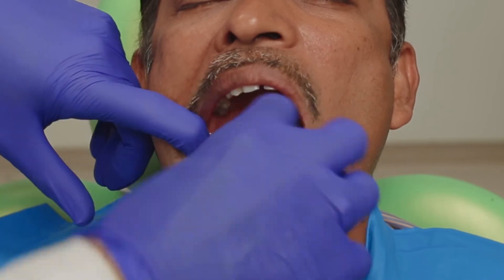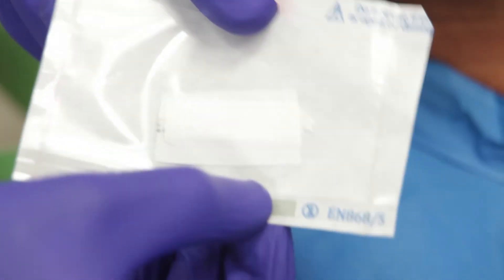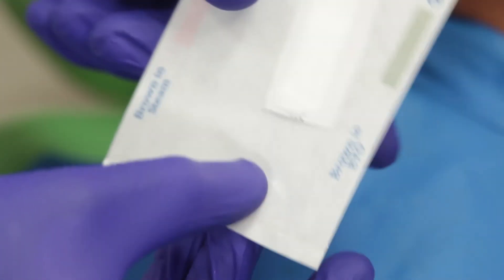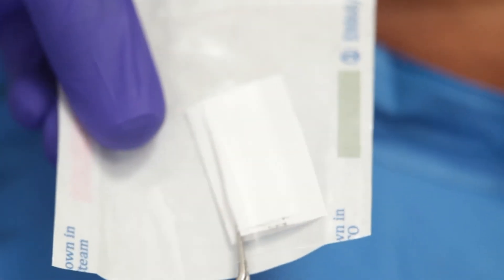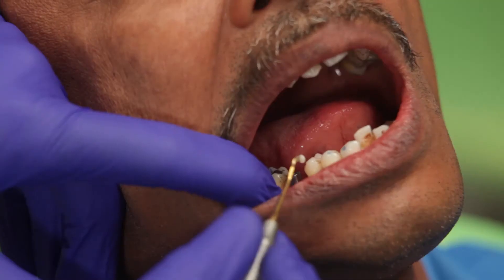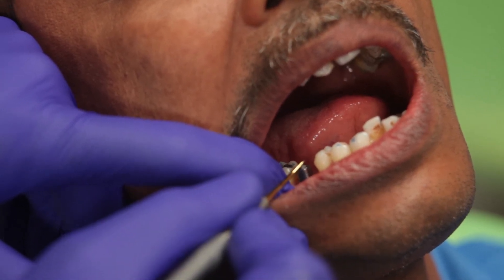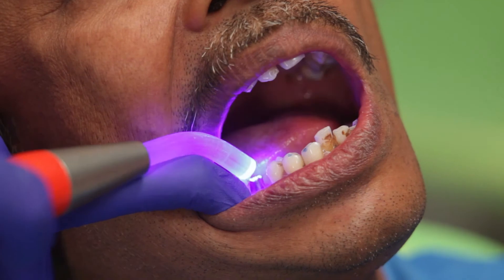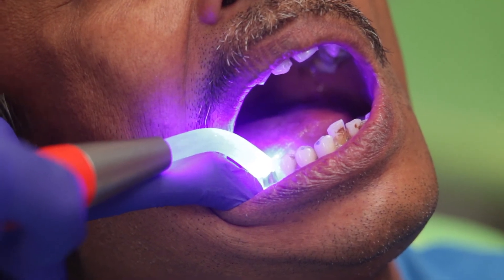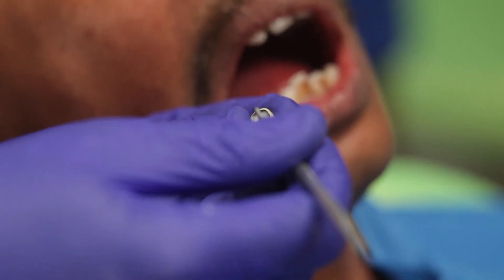I can now go ahead and try my crown once again before the final cementation. It is extremely important to block out the abutment screw channel before we cement the crown in place. Some people prefer to use cotton or gutta-percha but I personally like using some teflon. This is how the teflon goes in and I can now block out the hole with some composite. I will now mix some cement and all we need is a little bit of cement coating the walls of the crown.